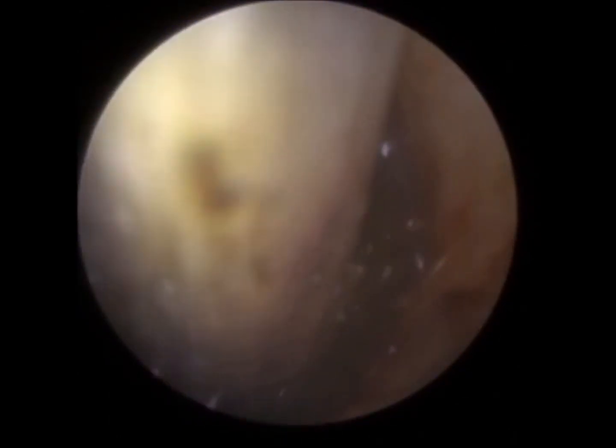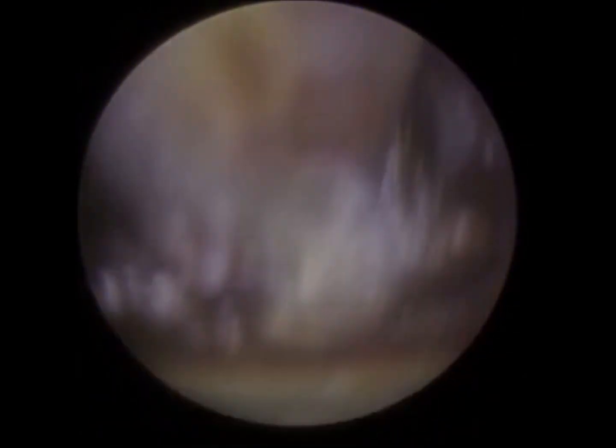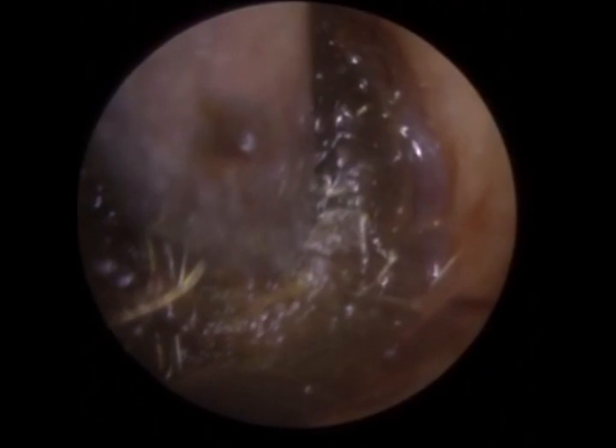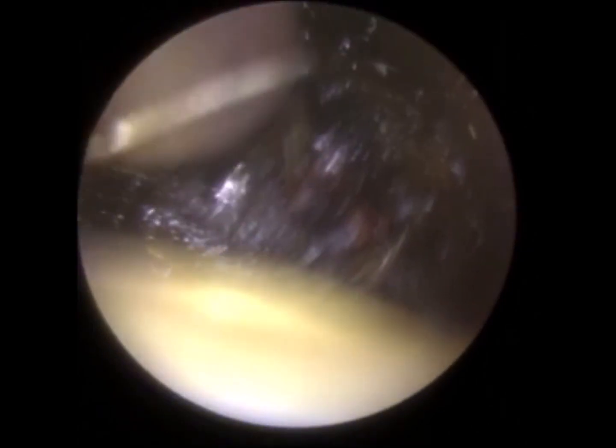So we're still more or less near the entrance of the ear, just at the base of the ear canal here. The wax posteriorly, so to the back of your ear canal, so to the left as you're viewing, it's a bit blurry just because of the oil, so that's what happens sometimes. The wax more posteriorly was a bit drier and firmer, and there's a bit more skin adhesions. So this wax had a range of consistencies. It was fudge-like, very soft and gooey in the centre. Some wax at the posterior was a bit firmer and crusty, and it's been there for a long time.